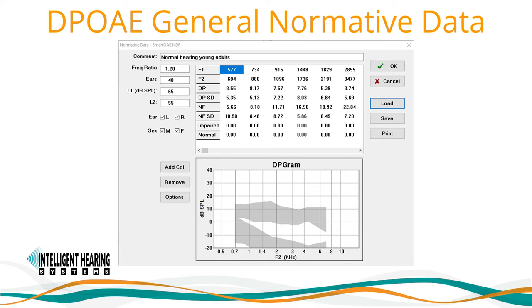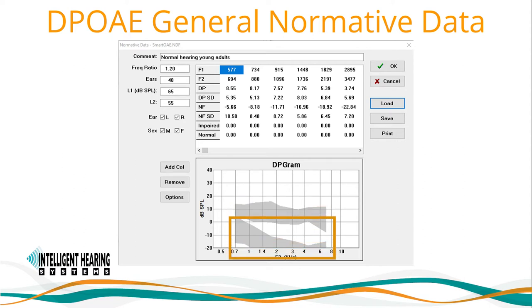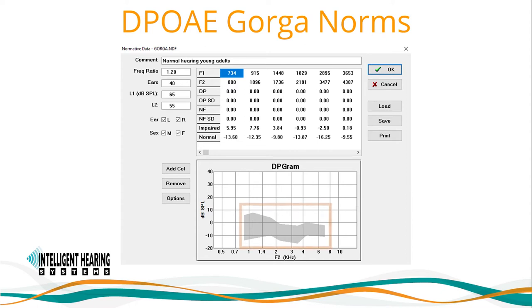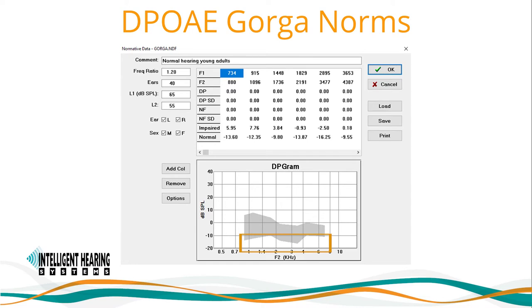You can select your normative data file. IHS offers two sample files: the smartoae.ndf file, which provides two shaded areas — the top shaded region shows where DPoAE responses for normal hearing adults typically fall, while the bottom shaded region shows where typically acceptable noise floors occur. The second sample file is the gorga.ndf file, based on published norms by Dr. Michael Gorga, where a single shaded region is displayed. Responses above the shaded region indicate 95% certainty of being true DPoAE responses, while those below indicate 95% certainty of being absent. Responses within the shaded region require additional audiological testing to determine validity.